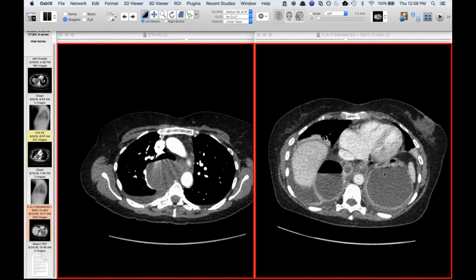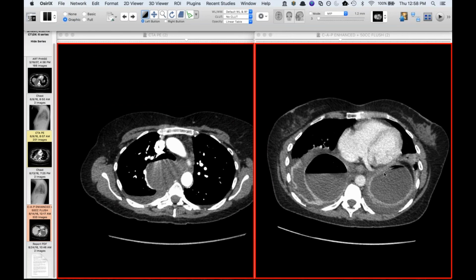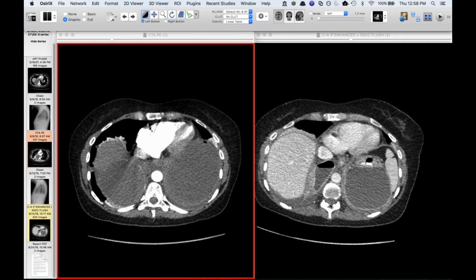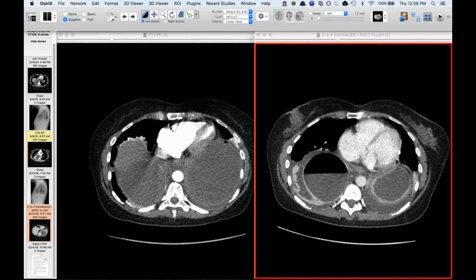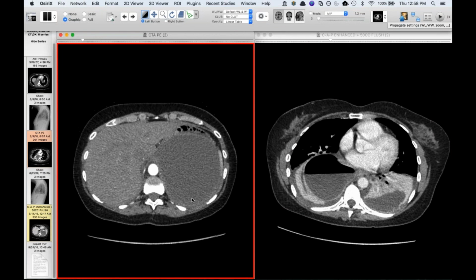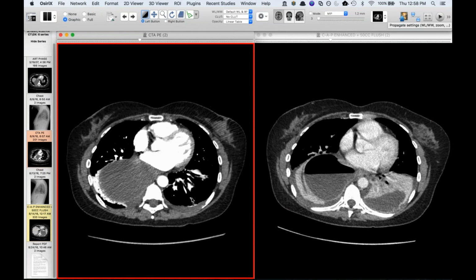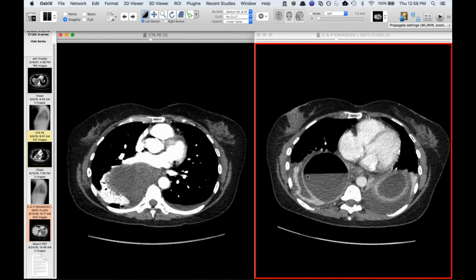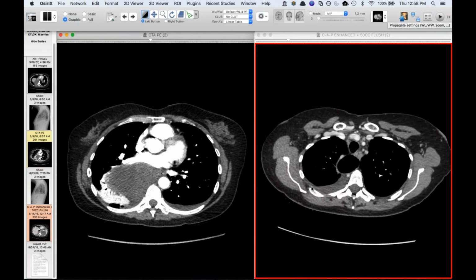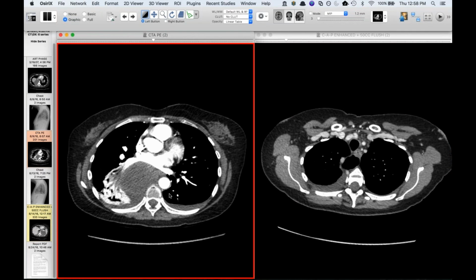They'd done a barium swallow. There was no communication before. And not only is there air in it, it's gotten smaller, and this portion looks like it's decompressed. So regardless of the etiology of the cyst, whatever this thing is, I thought it was probably super infected, but I thought it probably had to have decompressed somewhere, either into the right lower lobe or into the esophagus, given the fact that it had gotten smaller.